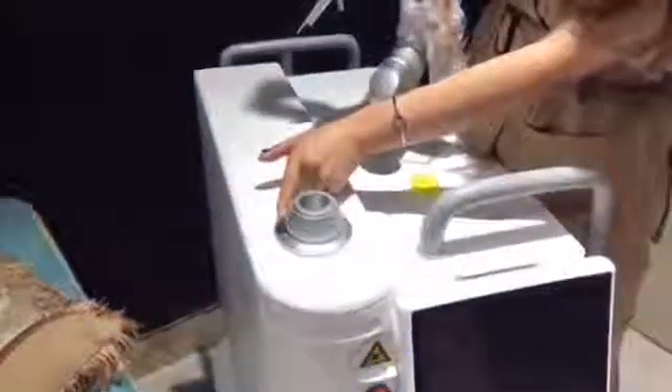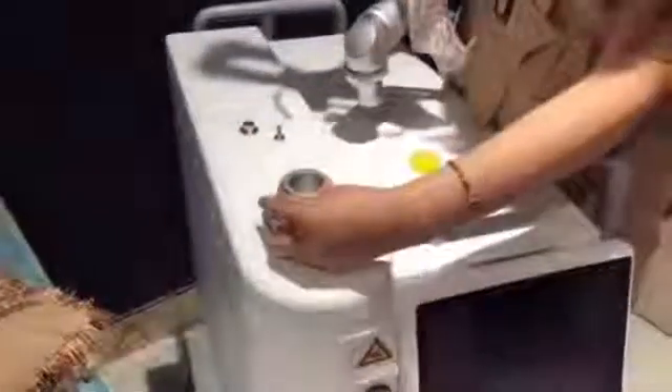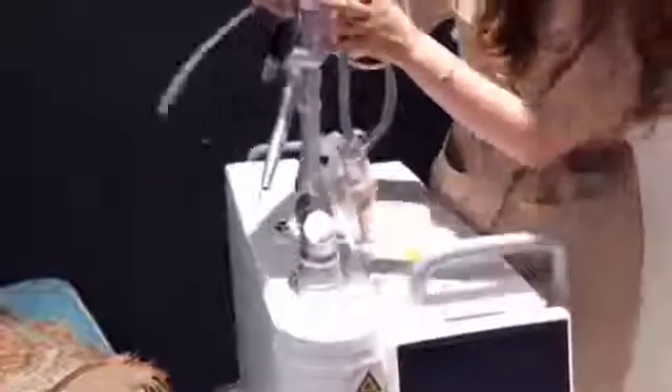Loosen the screw, insert the arm, tighten the ring, and tighten the screw.